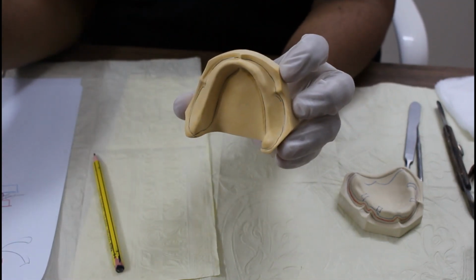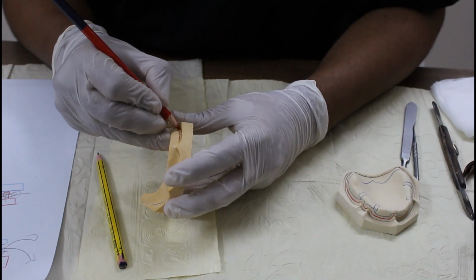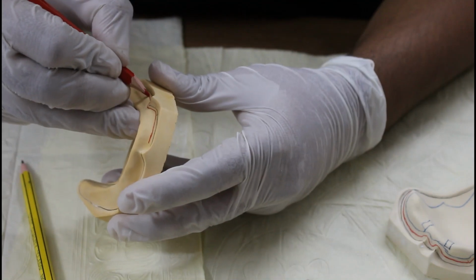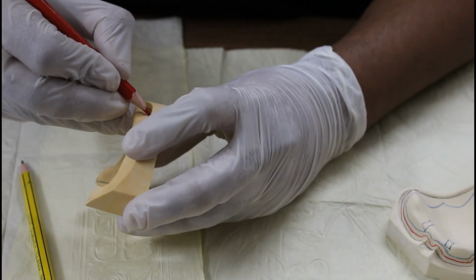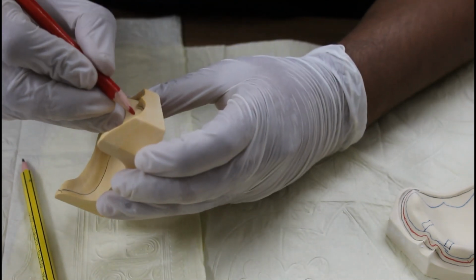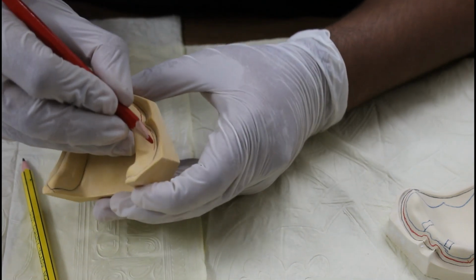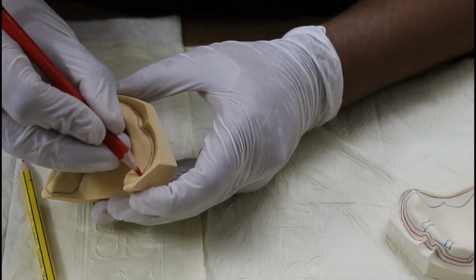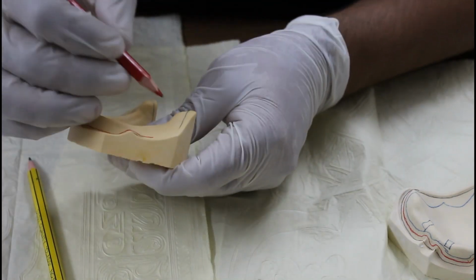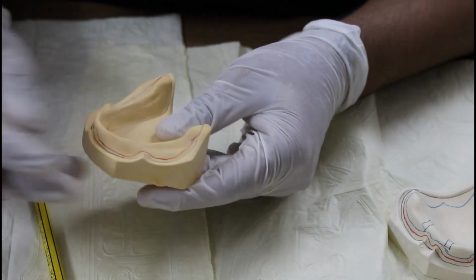Now take a red color pencil, mark a line 2 millimeter above the sulcus line. So this becomes your tray line. Posteriorly, join it in the retromolar pad area like this. Here also make it like this and join it here.